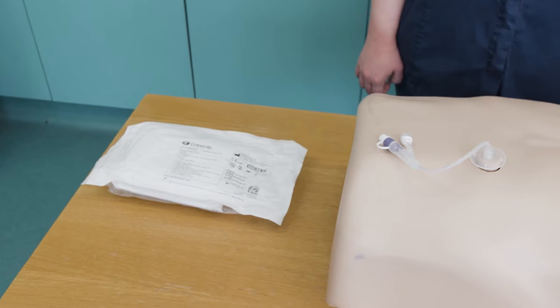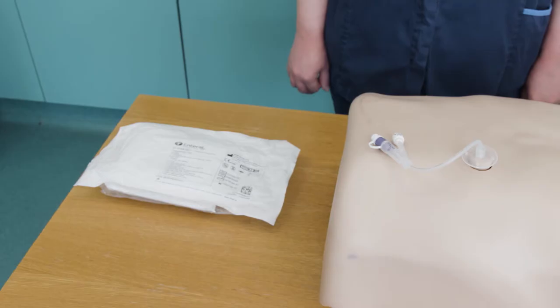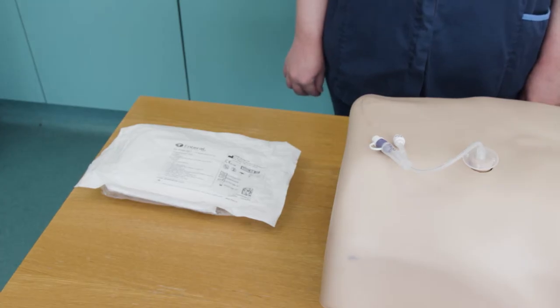Obtain the patient's consent and cooperation by explaining the procedure and agreeing a signal if the patient wishes the procedure to stop. If the patient is unable to consent, the medical capacity assessment and best interest decisions should be documented.